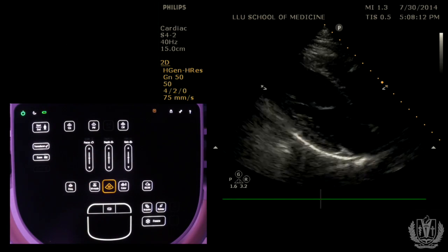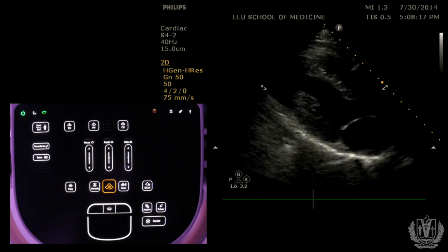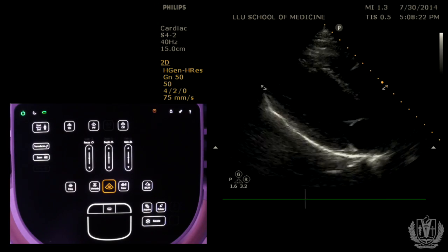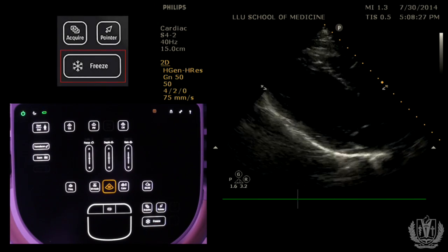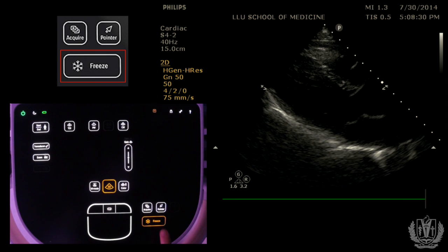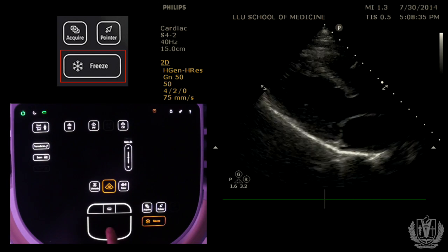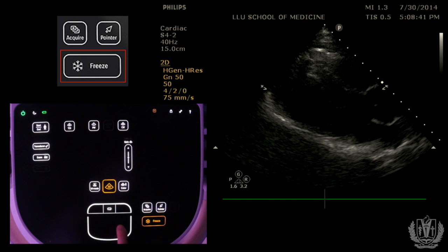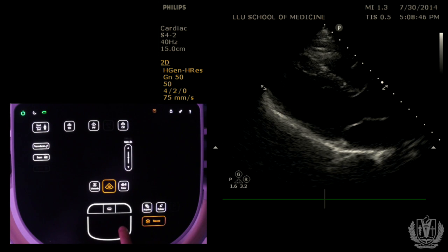Another important application is the freeze button. When you have a structure moving fast and want to examine a single image at one point in time, you can freeze the image and then scroll back. Here is the parasternal long axis view of the heart — freezing it also lets you scroll back through several beats to review an area of interest. If you push acquire or save, that will save the image to the system for later review.